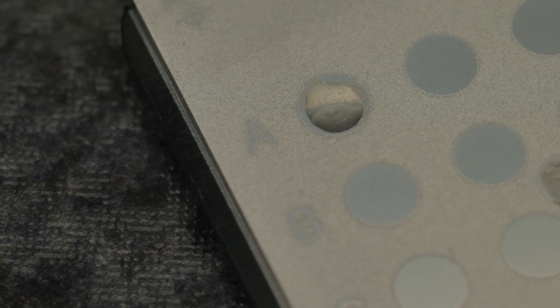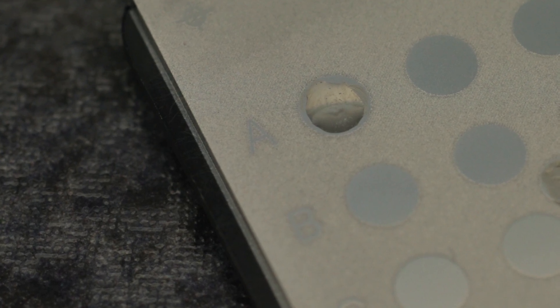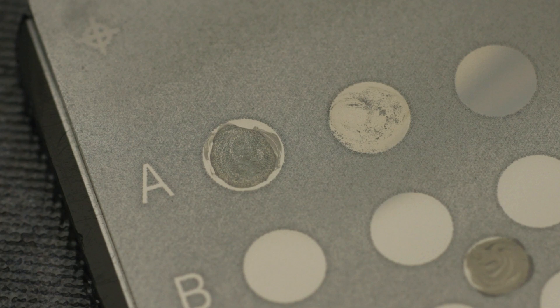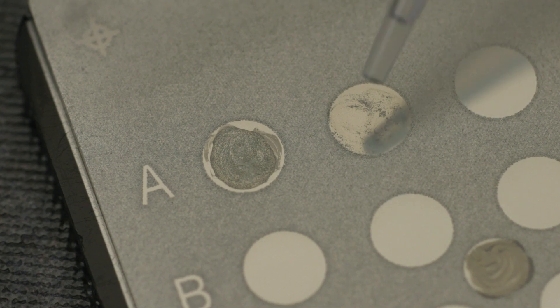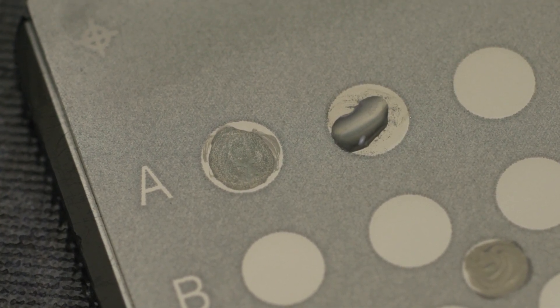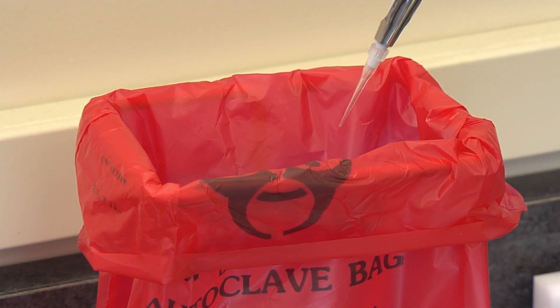Do not allow the sample to dry before adding the matrix. No more than two spots should be prepared before matrix is added to ensure the sample is moist. If isolates are to be tested singly, matrix should be added as each spot is prepared. If isolates are tested in duplicate, matrix can be added after both spots are prepared. Discard the used pipette tip, and always use a new tip every time the matrix vial is entered.